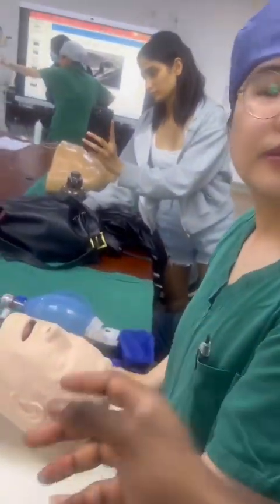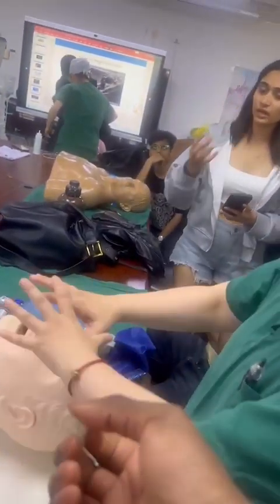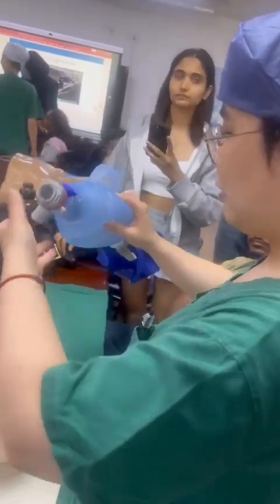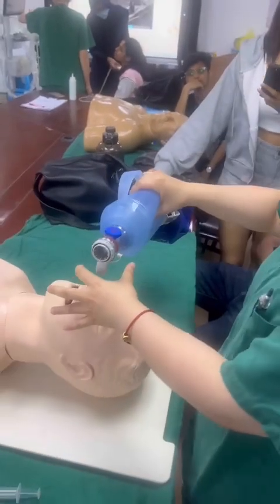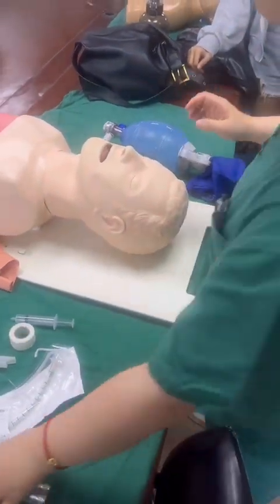Where were you putting the oxygen? Mouth or nose? With the mask. Because we don't have it now. So you would do the action. So there will be marks on the exam, right? Yes, we can read it here.